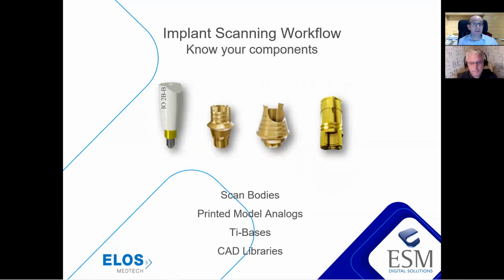Some of the key components involved in digital implant workflows is the scan body. That's the key, that's the first step. And after that, we've got, generically speaking, what we call tie bases, or for ELOS, we call them hybrid bases. These are components that we use for screw retained crown solutions. We also need a printed model analog solution.